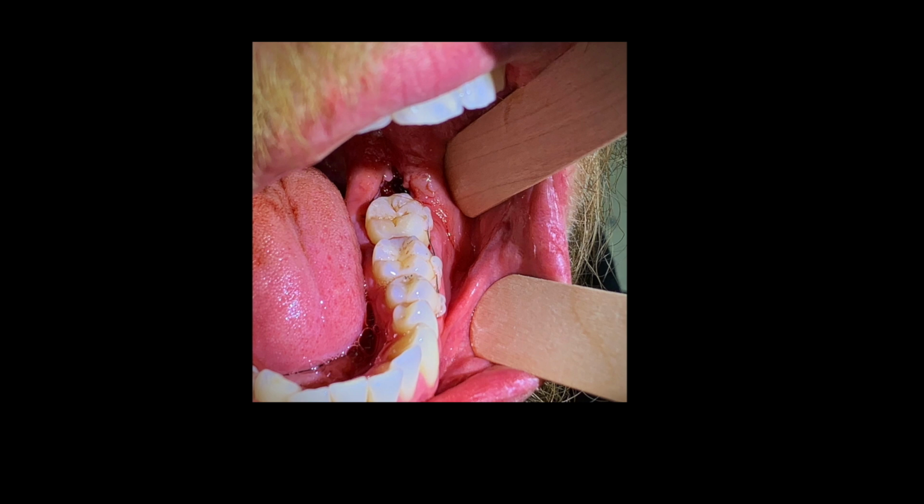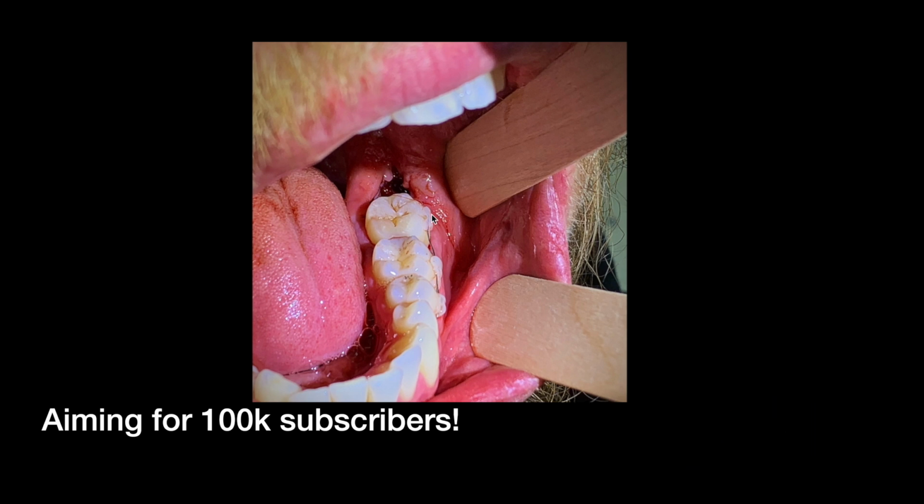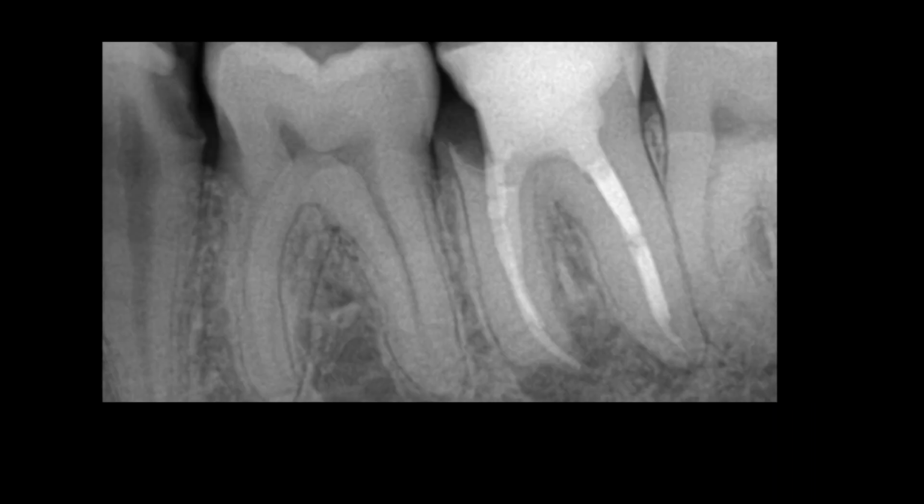So let's go ahead and take a look at this. This picture here is right post-operative. He extracted the 7, you'll see why in a second, and he took a 014 nickel titanium wire and bonded it. This is the original situation here. The third molars were getting extracted anyways, all of them, if I recall. He was sitting in his office thinking, why don't we take this 3.8 and put it in a 3.7 position, because this is non-restorable.